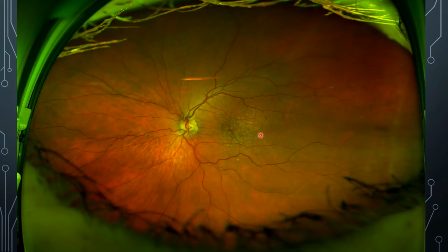So this person has an early, actually I'd say more early to moderate macular degeneration development, and when they're soft, that's not a good sign. It suggests that this is going to evolve more quickly, and it's going to be more destructive.